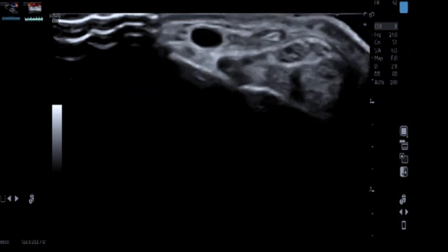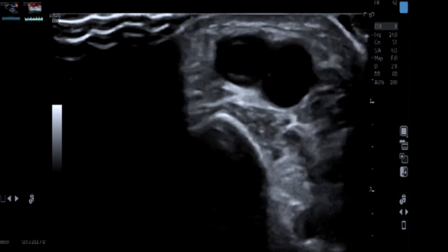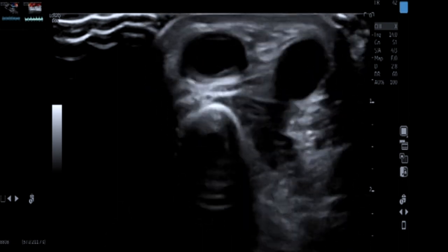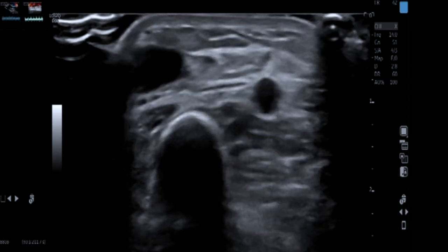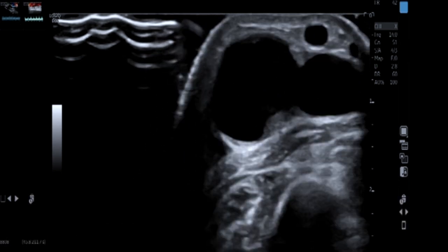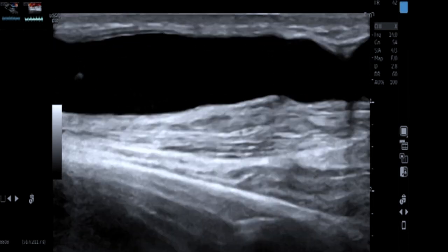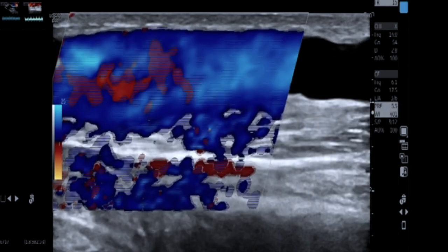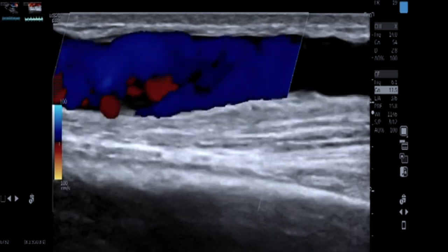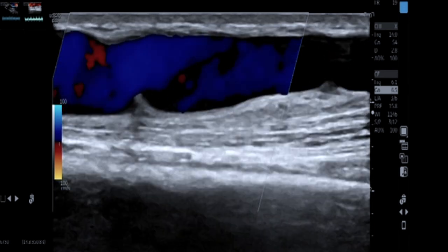From caudal to cranial, we trace the fistula — this is the artery, here is the actual anastomosis, and we come proximally along the draining vein. The volume flow in a fistula is an important calculation and must be taken roughly 10 centimeters proximal to the anastomosis. For volume flow, it's important to get the time-average mean velocities by sampling at least three to four cardiac cycles. Manual tracing is preferable unless your machine's auto settings are reliable.